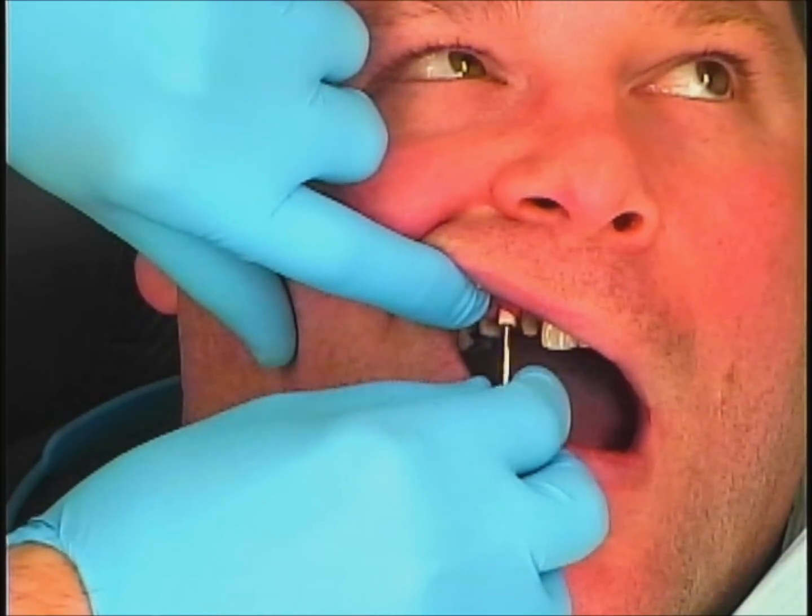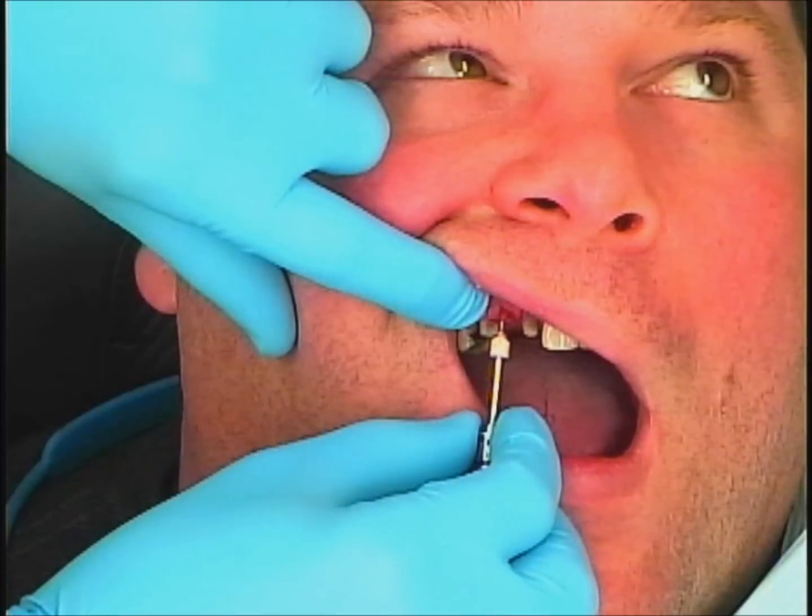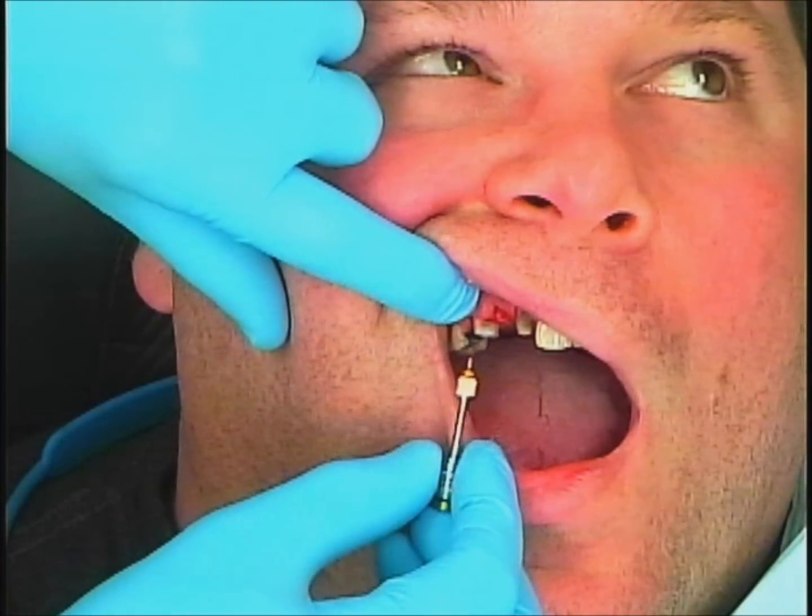Here you see I'm removing the healing abutment, which with this system is made out of PEEK material — very tissue-friendly. It's not metal.